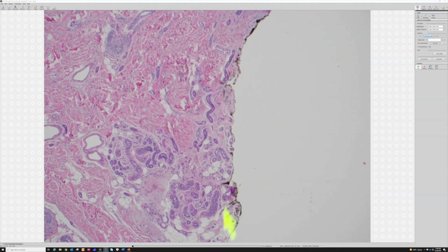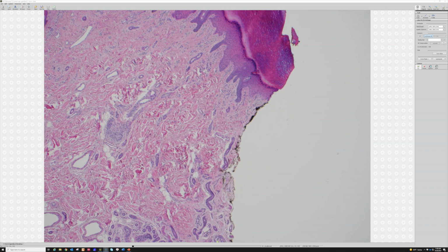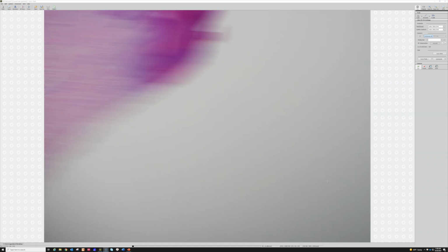Okay, and you can follow this sweat duct as it goes from the eccrine coil, the sweat producing portion of the sweat gland, and then it turns into the duct, and then the duct winds and twists its way all the way up until it empties out on the surface. So you can't see the whole thing because it's curving and twisting. We're only seeing the parts of it that are in the plane of the section of tissue that we're looking at.